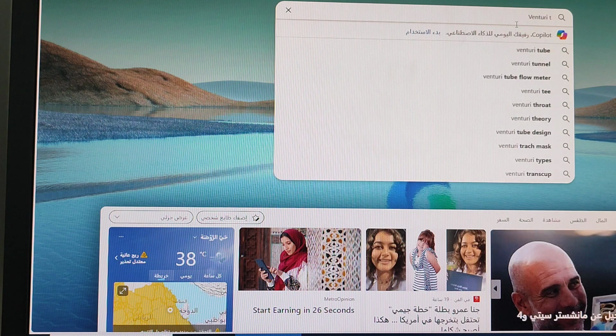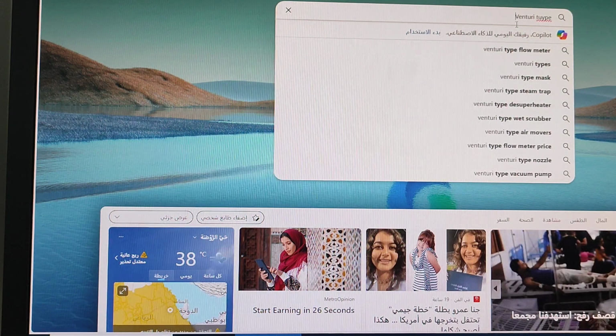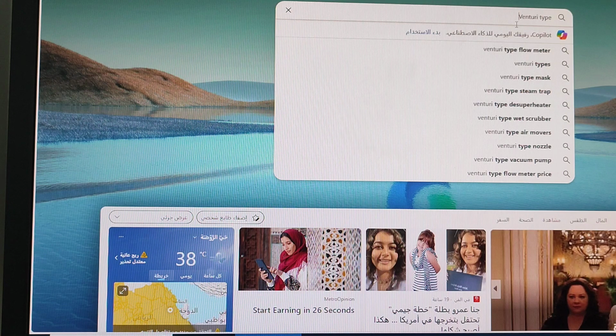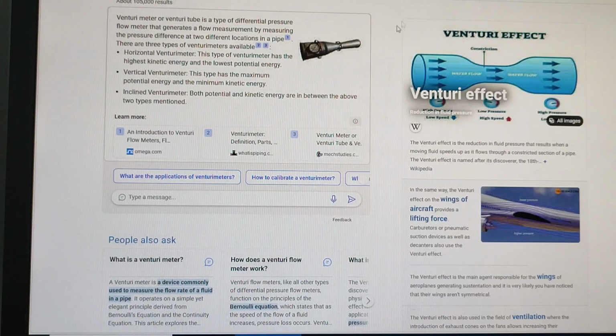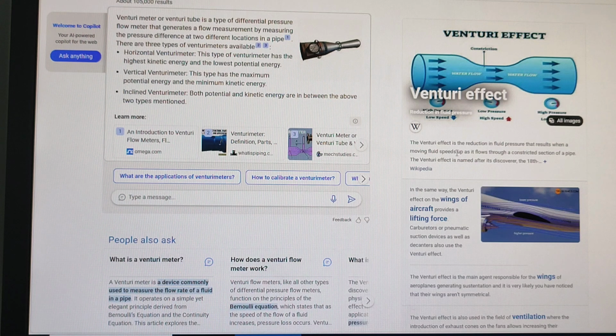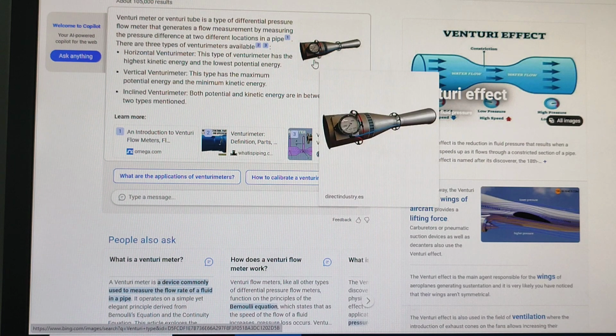Okay. Venturi type. Yes, Gyron, you are raising your hand. So let's see. The Venturi system has two sizes. One is big, one is small. Yes, the size exactly. The pressure depends on the size, and the pressure in the small one you can calculate.